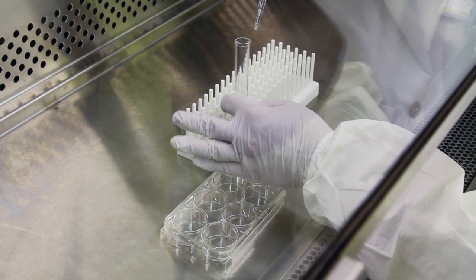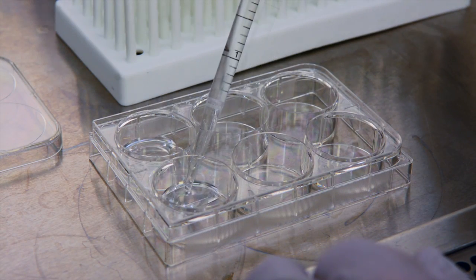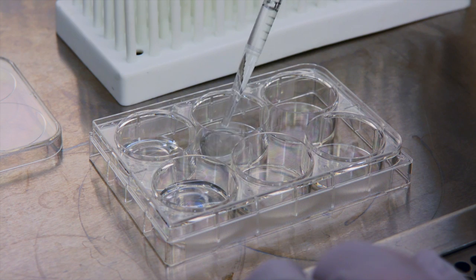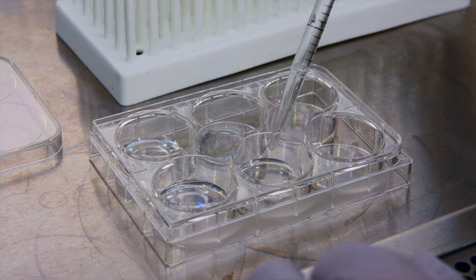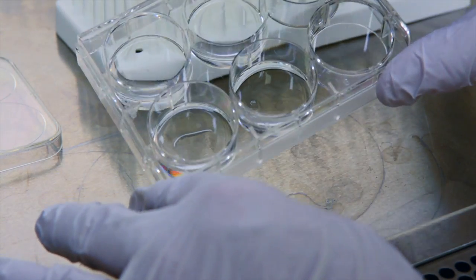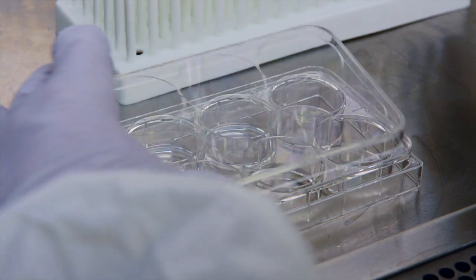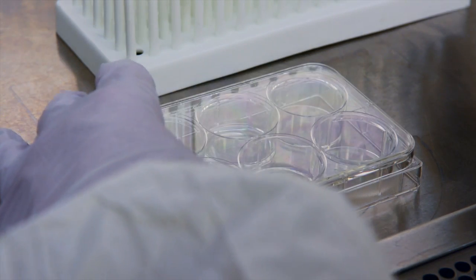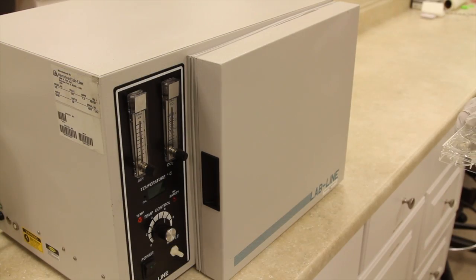To form the gel, pipette the collagen mixture into the desired cell culture plate, disc, or flask. Incubate at a temperature of 37 degrees Celsius and allow a minimum of 40 to 120 minutes for complete gel formation.